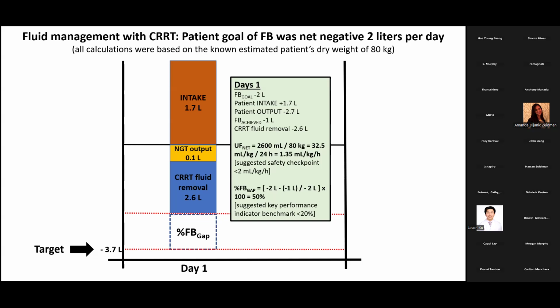And why this is important? Because, and I will show you in the next slides, there is evidence now that suggests that if you are too aggressive with your net ultrafiltration, you can also compromise the patients, particularly for organ recovery. And this is something, of course, that makes sense, but you need to keep in mind that that data comes from studies that have not selected the populations for only patients in which fluid removal is the main indication for CRRT. So it's taking a whole CRRT population.